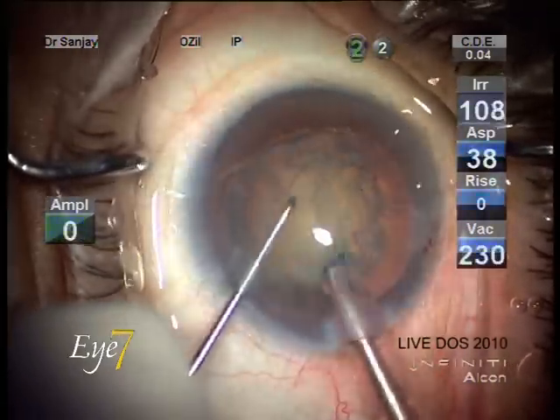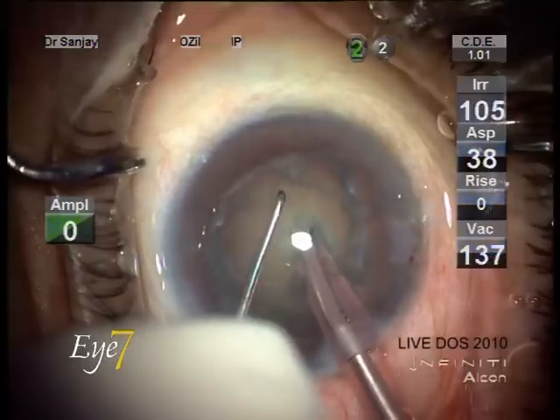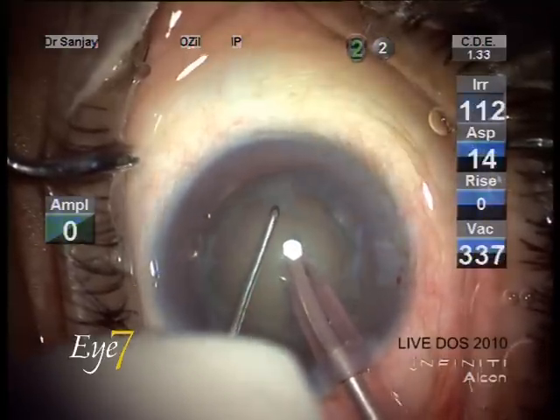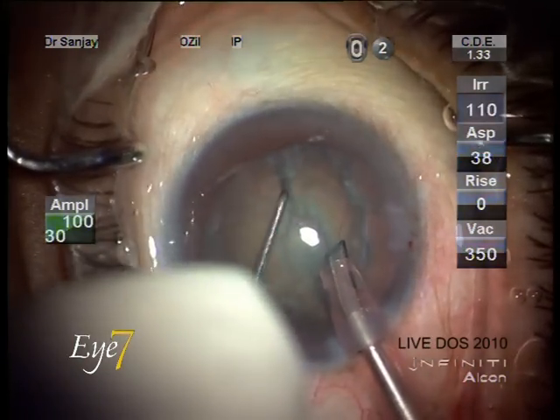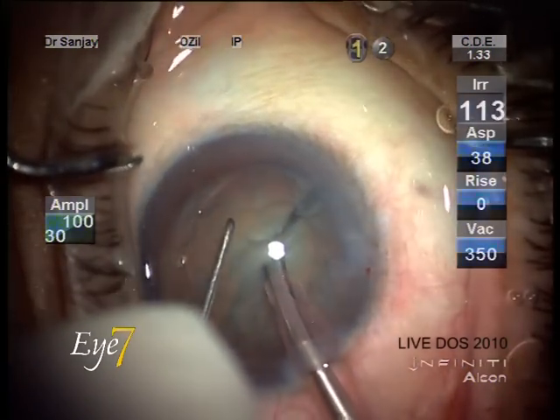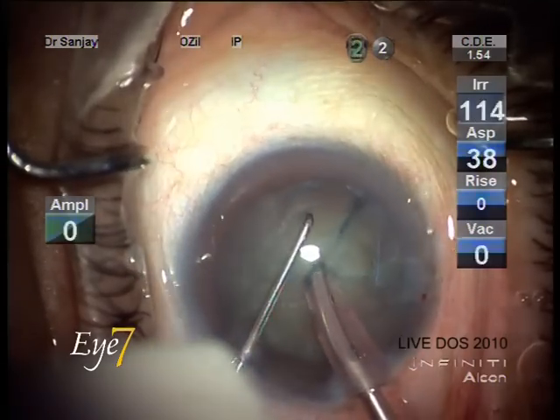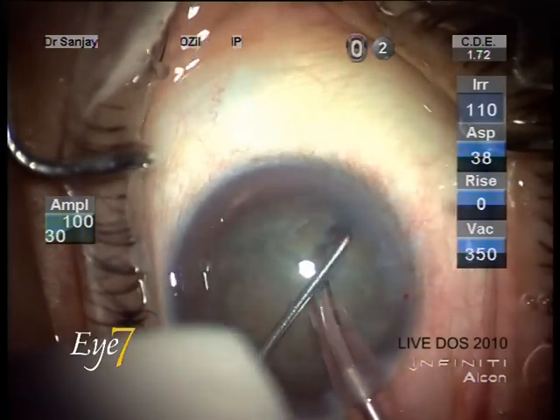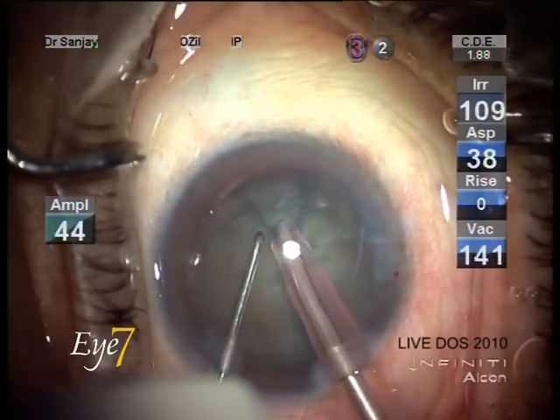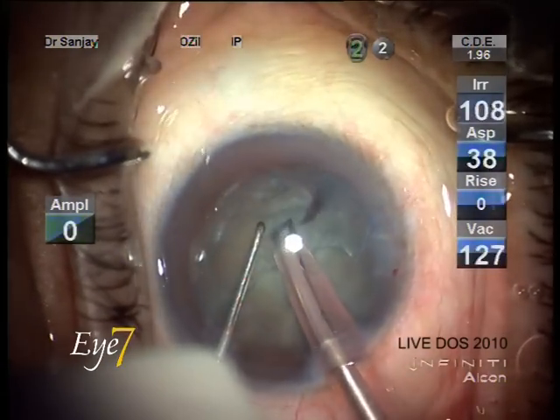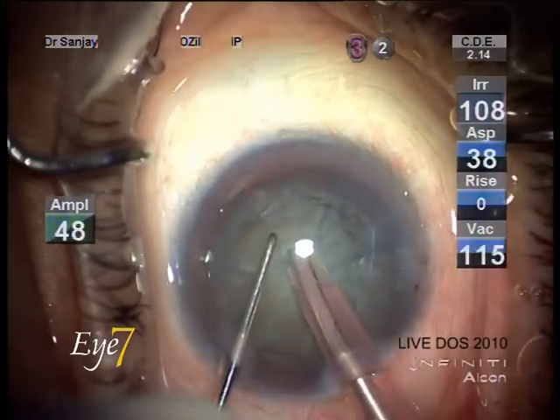The technology being used is the Ozil technology with IP, called Intelligent Phaco. When we increase the phaco energy and the nuclear fragment is hard, at a certain level the IP gets activated and adds longitudinal phaco to the transverse phaco, cutting the nuclear fragment better and preventing it from jamming to the phaco tip, ensuring the fragment moves more comfortably into the phaco machine and tubing.